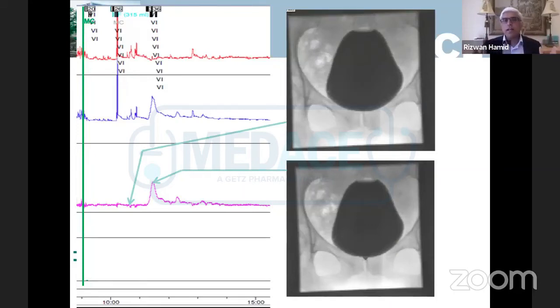So this patient has, we are assuming, and you take my word for it, no bowel symptoms, no sexual dysfunction, no neurology, and therefore what she has is what we now call isolated dysfunction of non-relaxation of the external sphincter. Previously, it was known as Fowler syndrome. So her external sphincter is not relaxing, and she is suitable for the treatment Shahzad mentioned, sacral nerve stimulation. But you need to know what you are looking for, what the urodynamic question is. So this is very important.